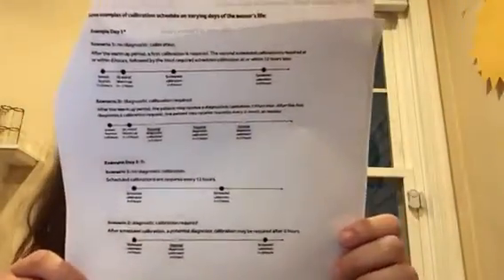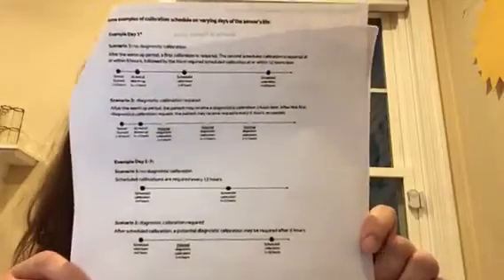Okay, so this is their example. Some examples of calibration schedule on varying days of the sensor's life. I'm actually not going to read this. I'll put it back up there. You can pause your video if you want to study it. Print it, take a picture.